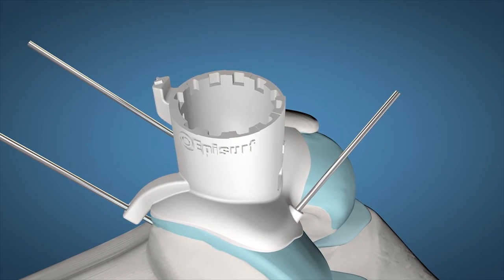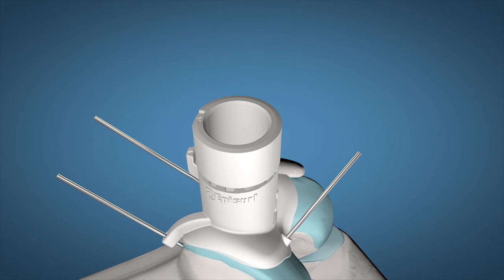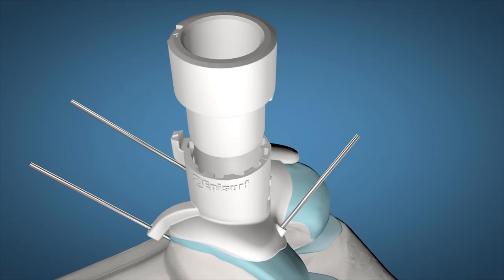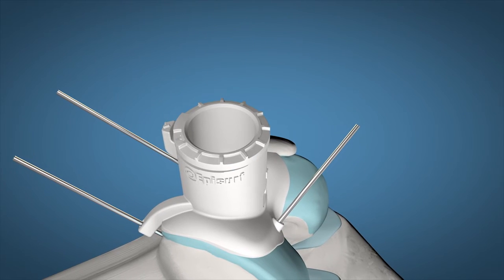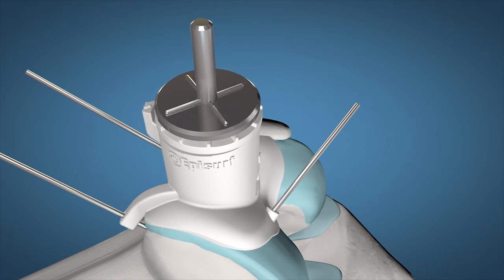The EpiSelar knee is positioned to replace only the damaged cartilage and is inserted at the right depth and angle in relation to surrounding cartilage. Implantation need not always be symmetrical in the trochlear groove, but can be angled either medially or laterally, depending on the location of the lesion.